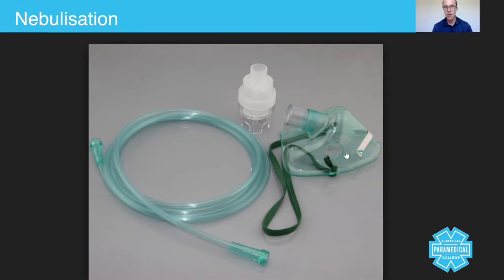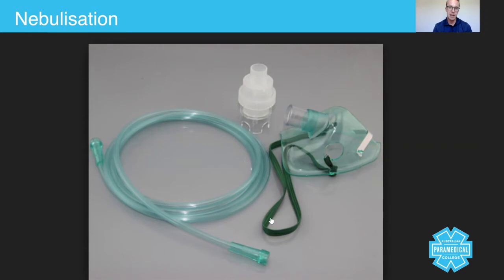With this mask, notice how you've got these exhalation CO2 ports which allow the patient's CO2 to be exhaled so they're not sucking in that carbon dioxide and making the patient acidotic. You've got an elastic band that goes around the back of their head, and you'll never be able to deliver 100% oxygen with any of these masks because the oxygen will always leak through the sides.